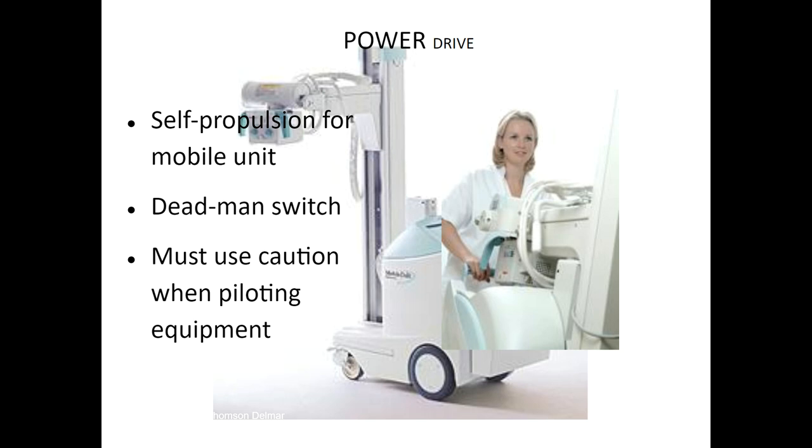They do get dirty, and they do need to be wiped down from time to time. I don't think people are taking the time to do that. I know we did when we would use these in the burn units. Has anyone been in the burn unit like at Cornell? Have you been there? I asked to go, but I didn't do any X-ray, there was nothing to do. Oh, okay, you just wanted to.